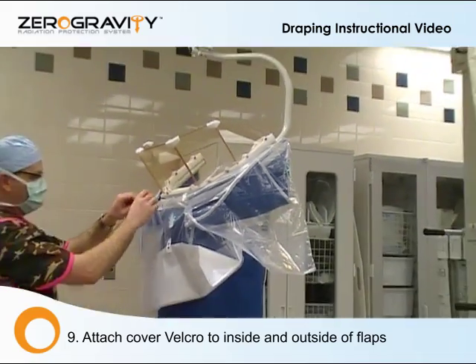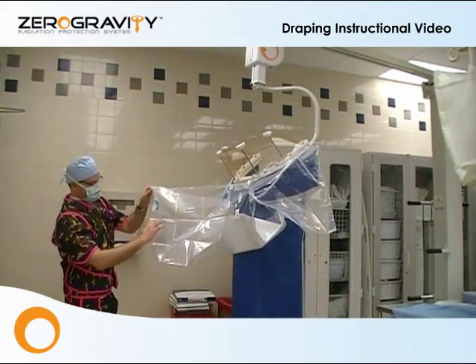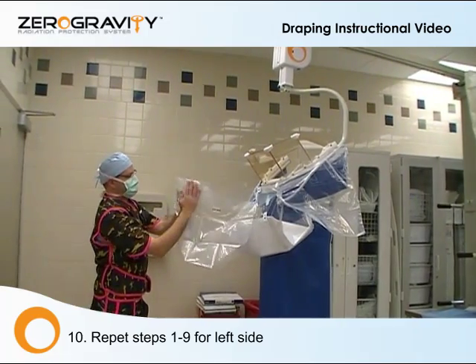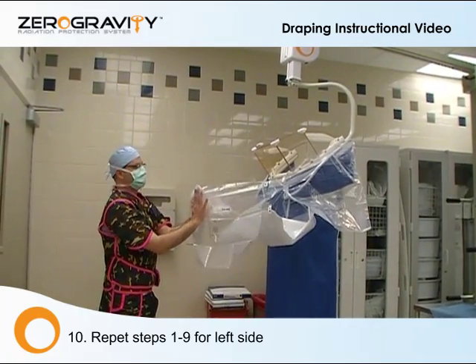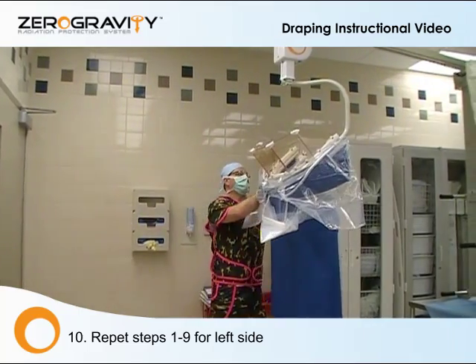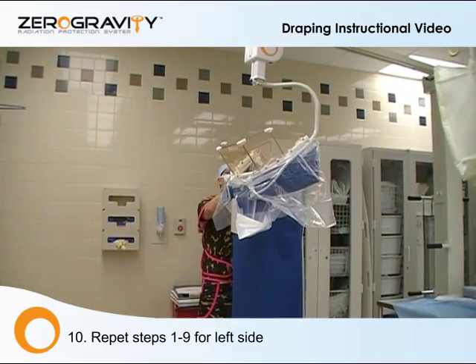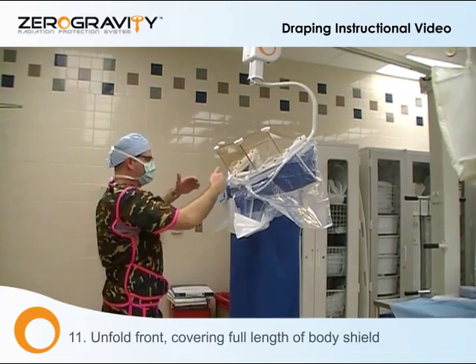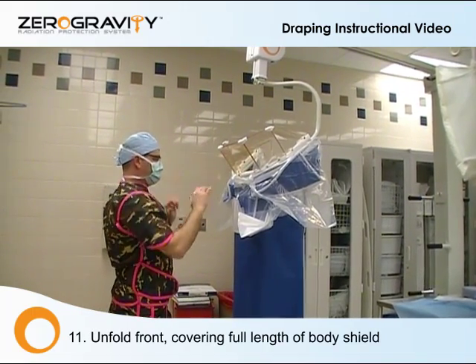Placing this piece of Velcro at the upper corner and the inside piece of Velcro in the opposite. Same thing happens on the other side. Place hands — one on this side, one on this side — open, creating a popping. Same sweeping motion, down and up, placing the Velcro on the uppermost corners.